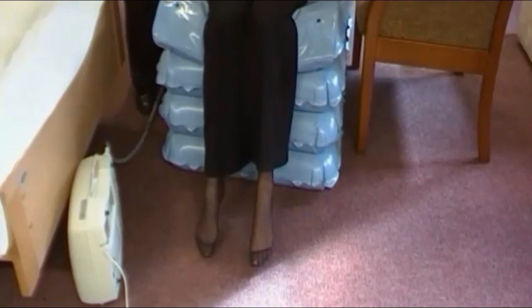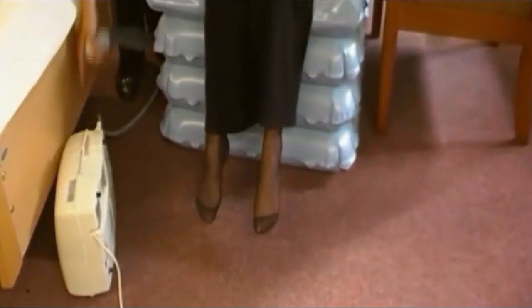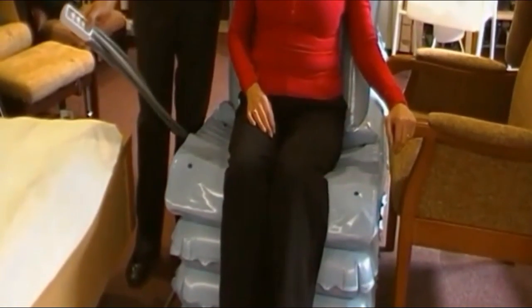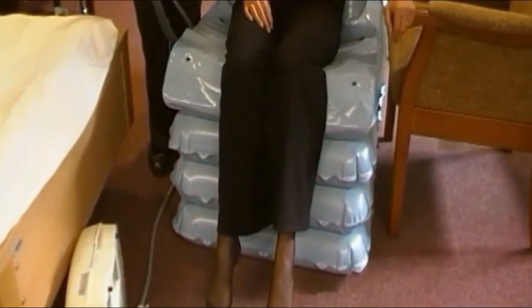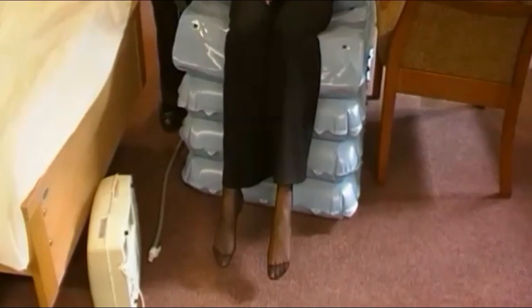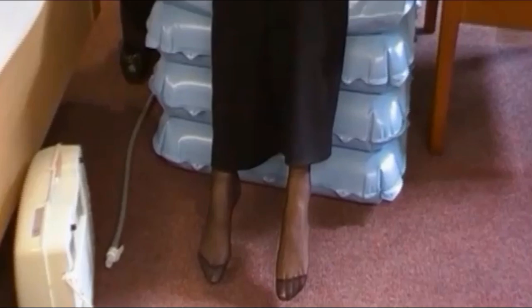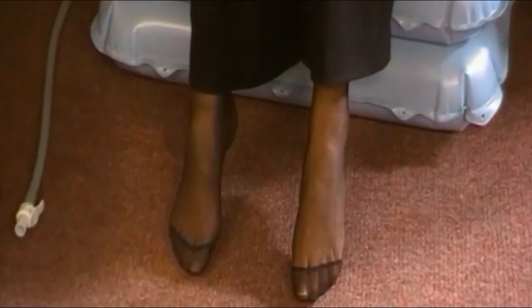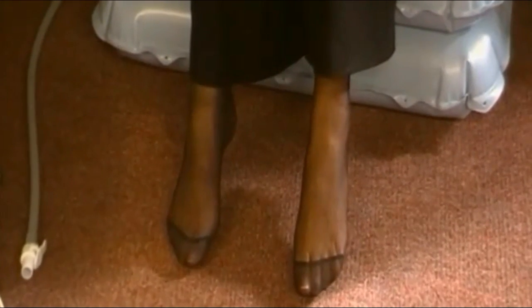See, Christine's feet are coming off the floor. We wouldn't need to lift her any higher. If you do go too high and you want to bring it down gently, if you take this little clip out here, the same buttons will work in the downward position. So if we press one of the cushions, we'll just bring your foot back down to ground level. And you'll be able to get yourself up.